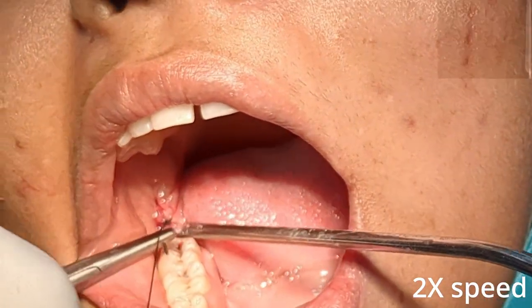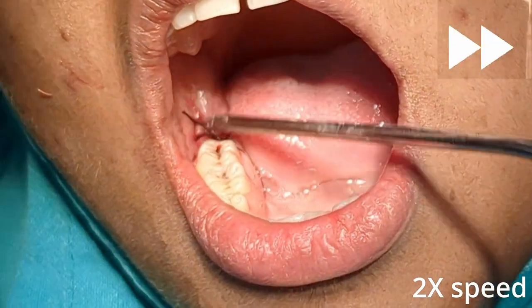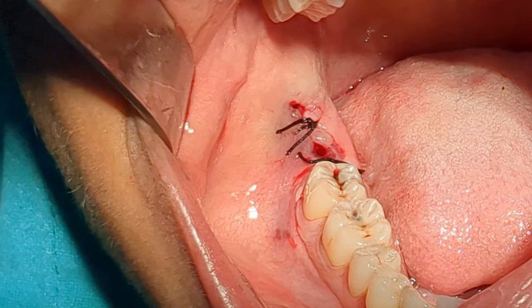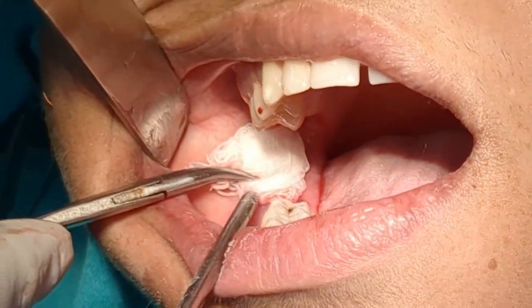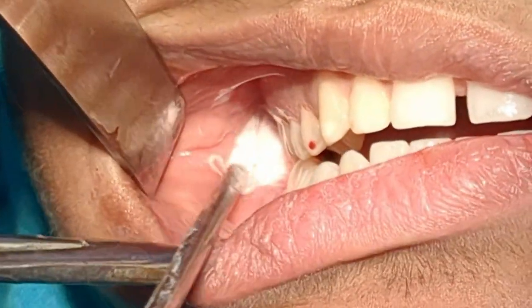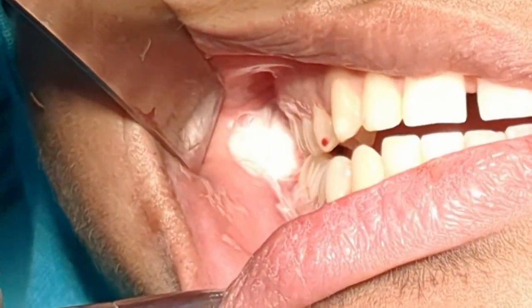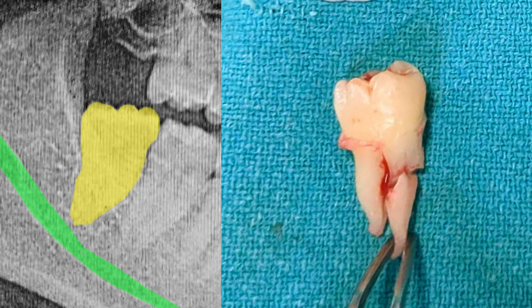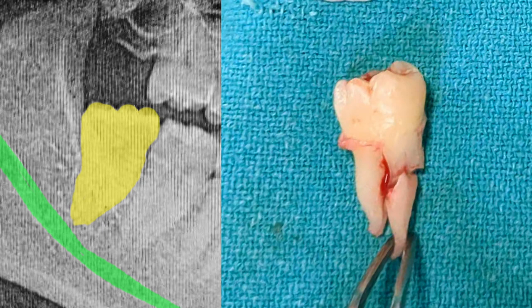This is how the flap looks like after suturing. I place the pressure packing on the extraction site, making sure that it does not interfere with the occlusion. That's my incredible patient, who is also my student, four days after the surgery. Thank you.